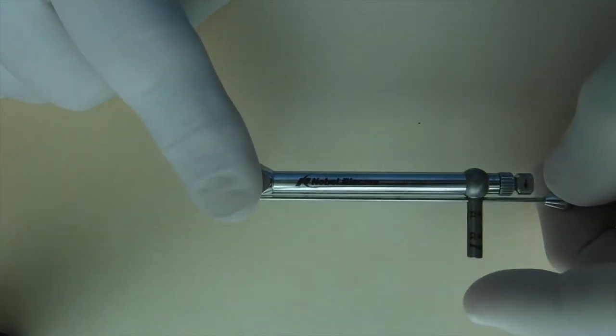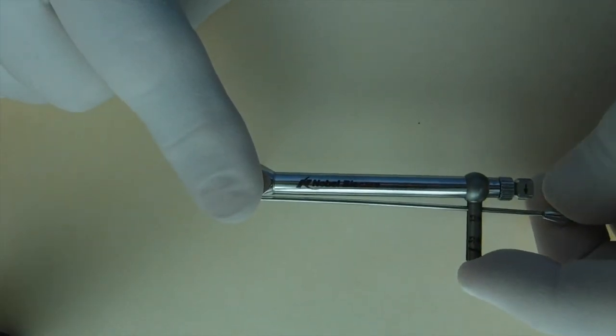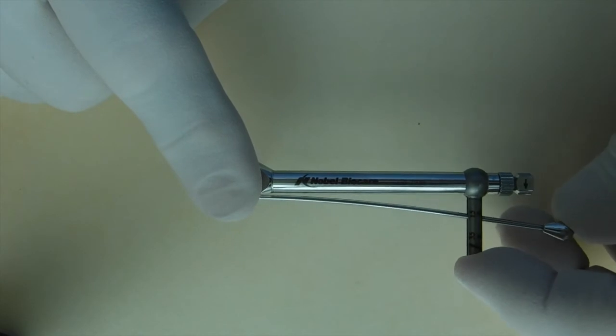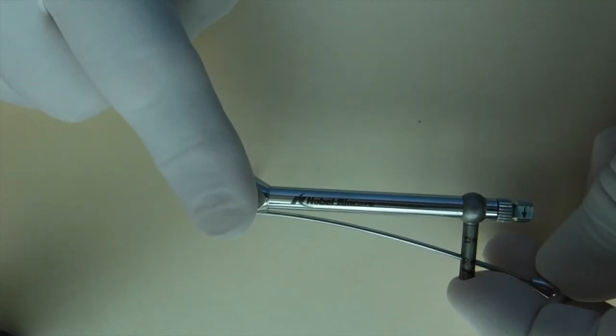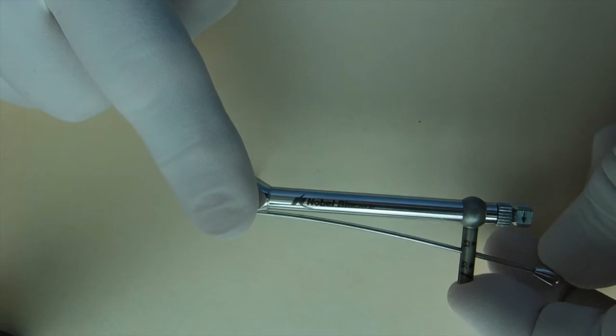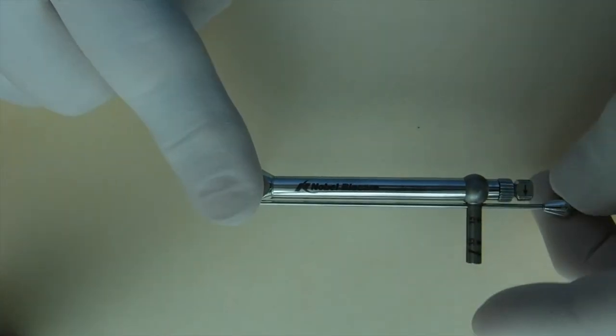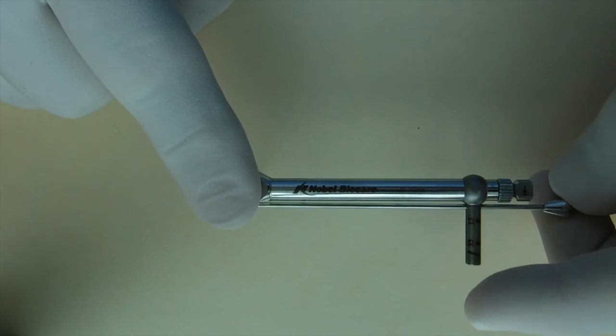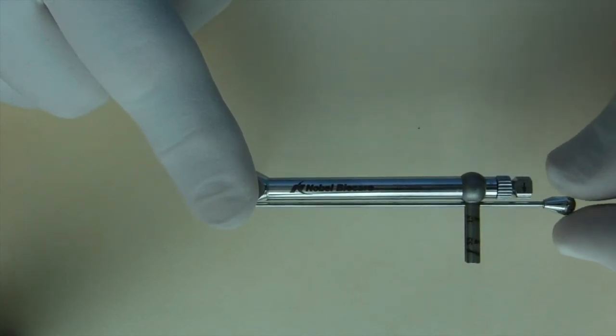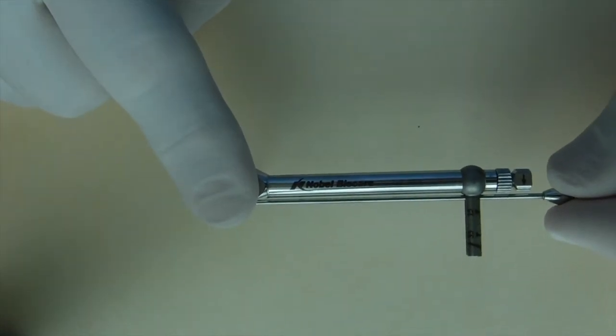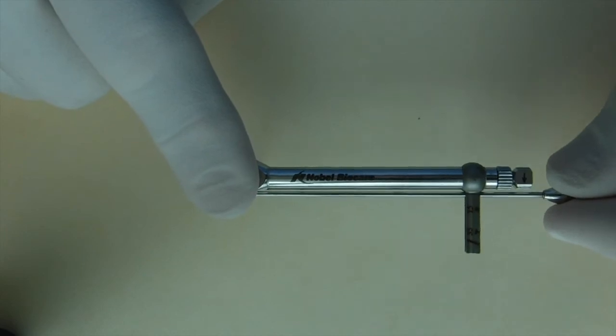As the torque force is applied, the beam will deflect until it reaches the desired torque value, in this case 35. My finger is only on the indicator bar for the purpose of the demonstration. It's very important that you only keep two fingers on the slender lever arm.